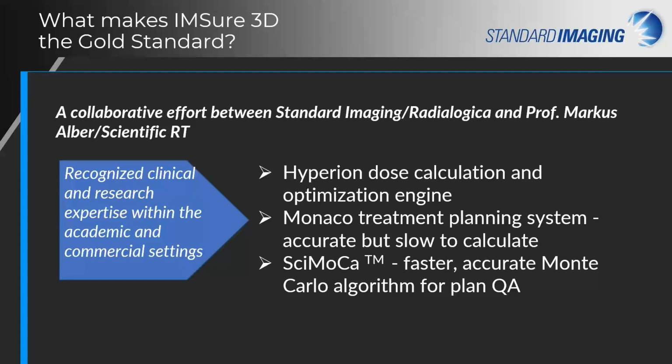Its strength is in the culmination of over 20 years of expert knowledge in Monte Carlo dose calculations by someone who's been defining and setting the standards in this area. Our customers will benefit from knowing their treatment beams are modeled to be as accurate and precise by the best in the field. This combined with IMSure 3D's streamlined, intuitive, and automated user interface sets us apart from our competitors.